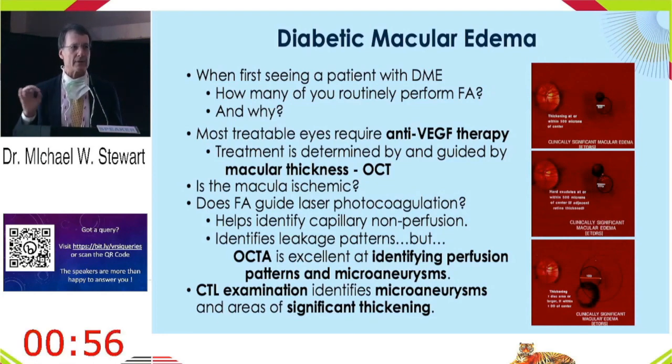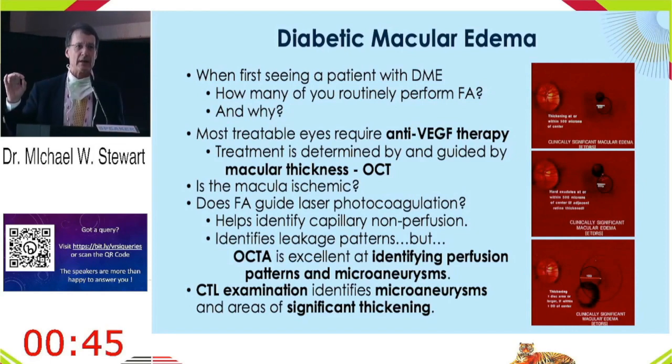And there's no doubt that OCTA does a really good job in looking at non-perfusion. Now, non-perfusion is not a limiting factor for whether we treat patients, but it is a factor in terms of giving patients a good idea of their prognosis.